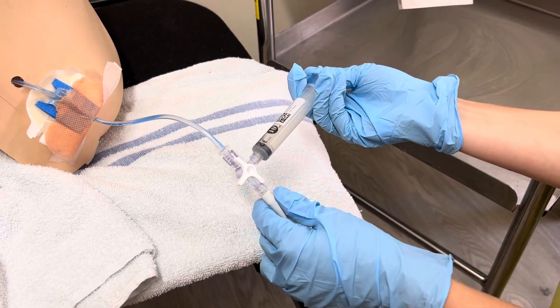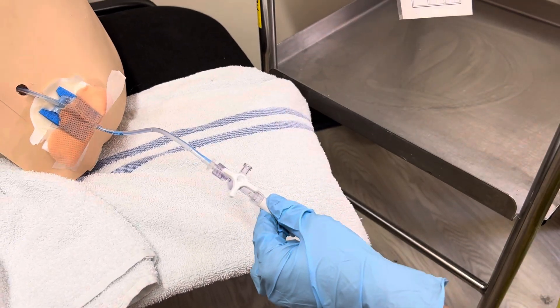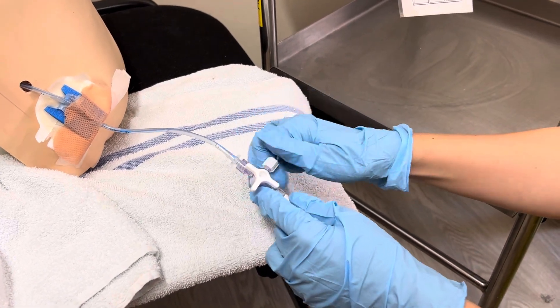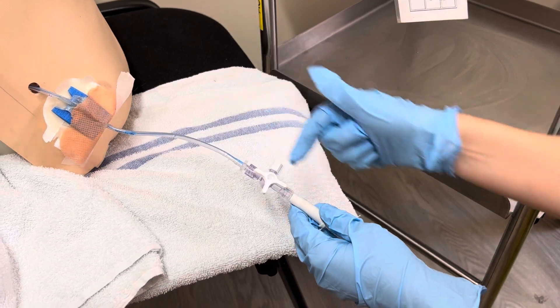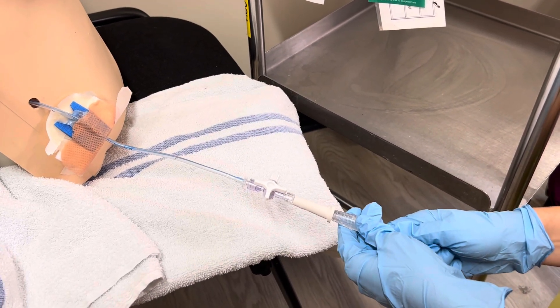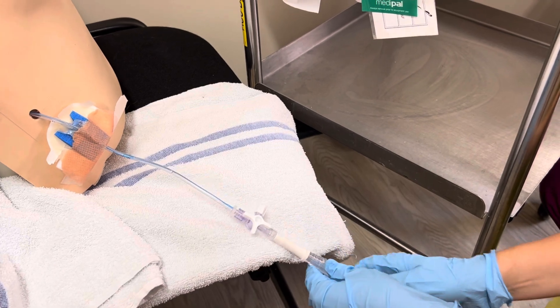Turn off again, take the syringe off, and you'll have your clean bung on your sterile field ready to pop back on. Then check for swinging — if you're struggling to see any swinging, just ask the patient to cough. And that's all, thank you.